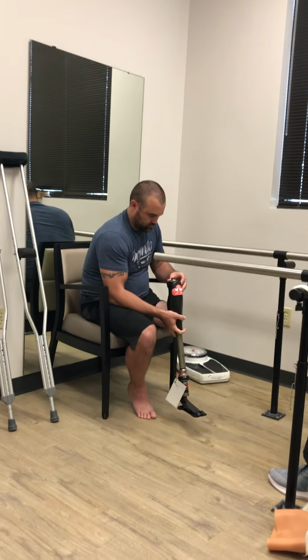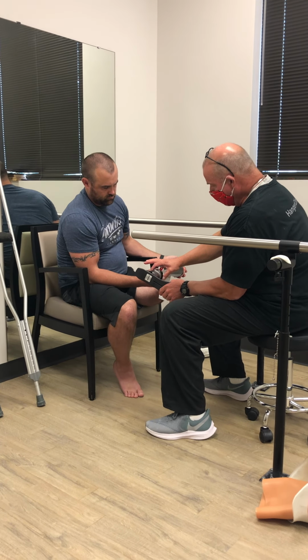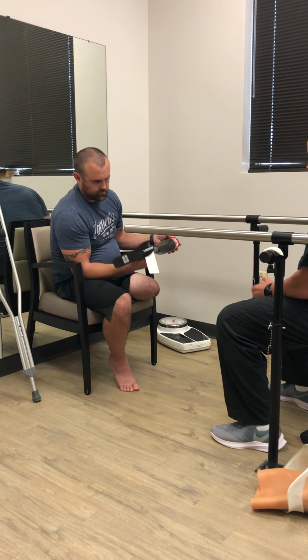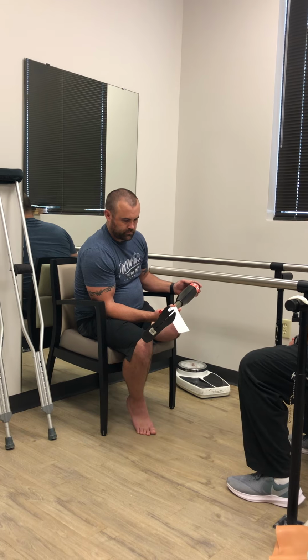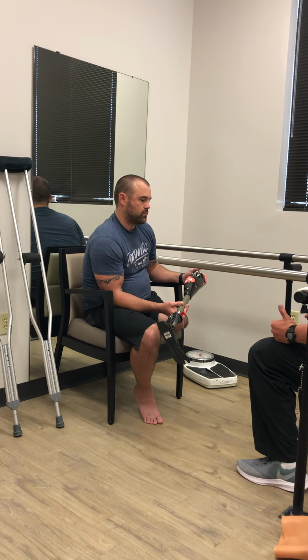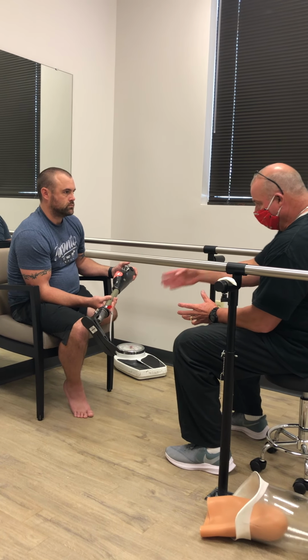I can do a different type of foot, but the benefit of this foot is the vertical shock. It's got this rubber grommet in here, and what that does is, if you come off a ladder or something like that, it actually compresses. It's based off your body weight. So I want to keep that in, and it'll be up to you to see exactly. I might have a little room here. It's not going to be a ton, but it'll give a little bit of room so we can probably come down with the rotator and this foot.